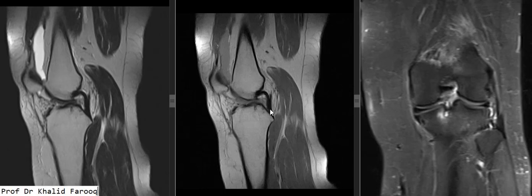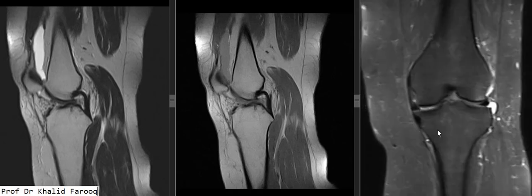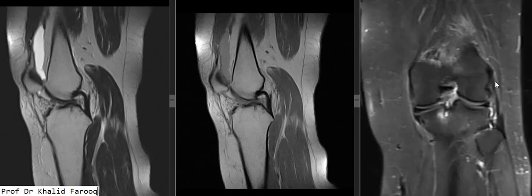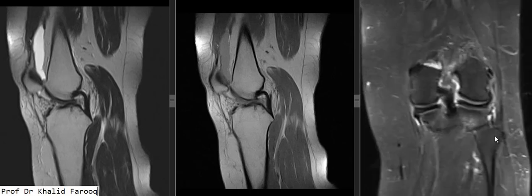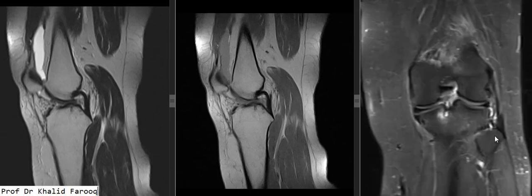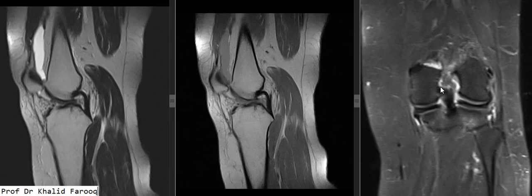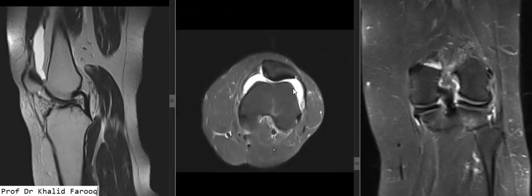The posterior cruciate ligament shows normal signals and morphology. The medial and lateral menisci, including the medial and lateral collateral ligaments, are unremarkable. On the axial fat suppression sequence, we can see joint effusion. The PCL shows normal signals and morphology.